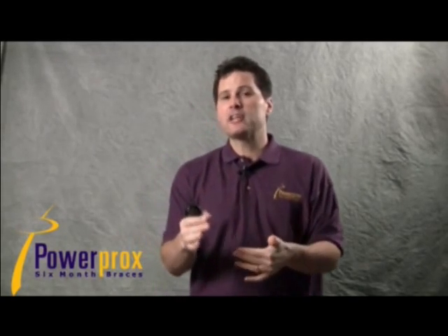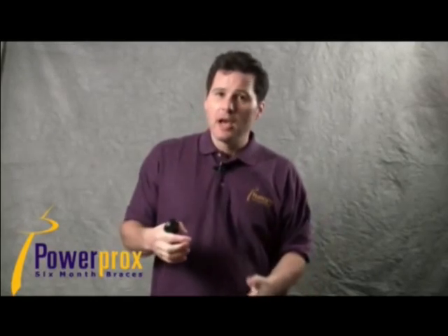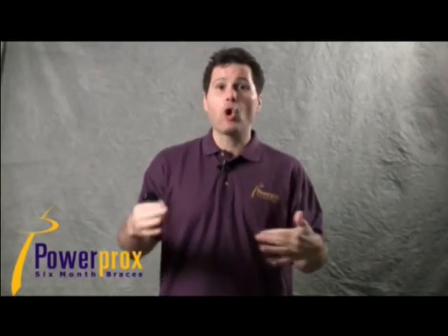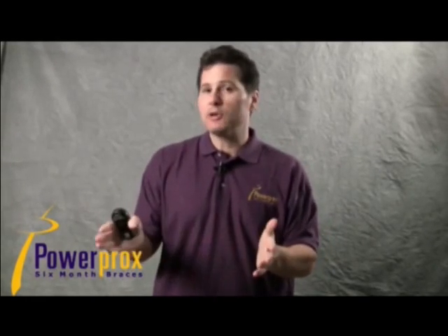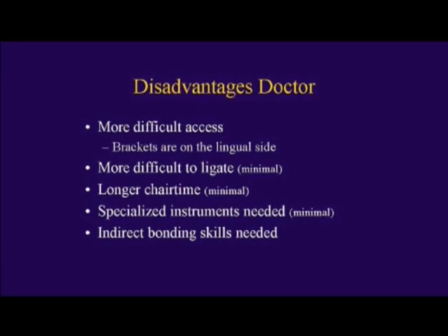A bit longer chair time, particularly initially. We're talking maybe an hour for total treatment time, not an hour for appointment. But if it takes you maybe 2 to 3 hours of chair time for a labial case, maybe it's going to take you 3 or 4 hours for a lingual case.